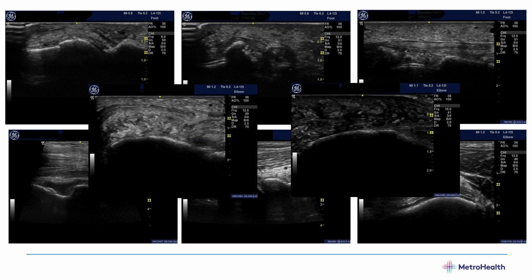His olecranon swelling looks to me like a pretty decent urate aggregate. As you see, as I reduce the gain on the ultrasound, you can still see some of the dots, fulfilling the idea that this is a urate aggregate. So I think with that, I'll end.